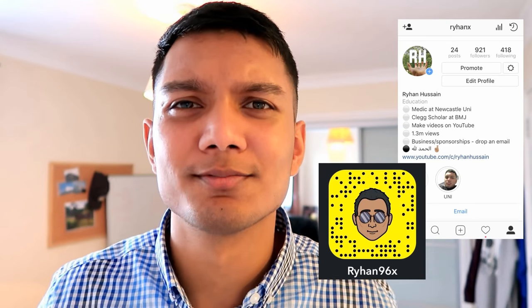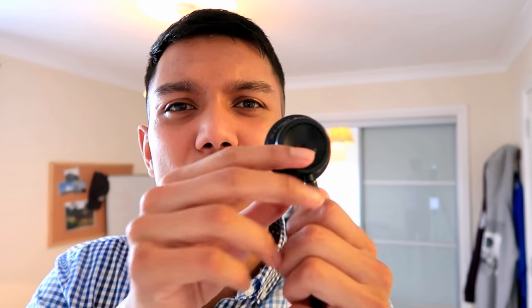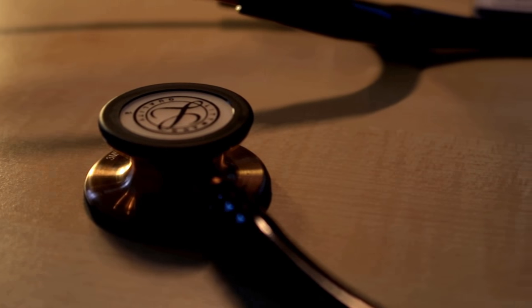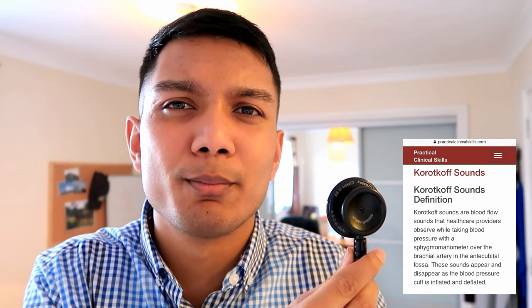Let's start with the actual video. Here's a quick guide on the different parts of a stethoscope. This is the head of the stethoscope. On the smaller side is the bell, and on the other side is the diaphragm. The diaphragm picks up higher frequencies like heart sounds and breathing sounds, while the bell picks up lower frequencies such as Korotkoff sounds when measuring blood pressure or detecting heart murmurs.